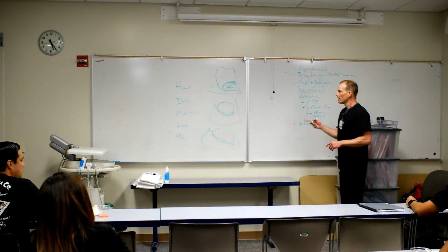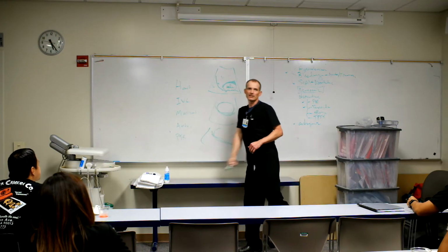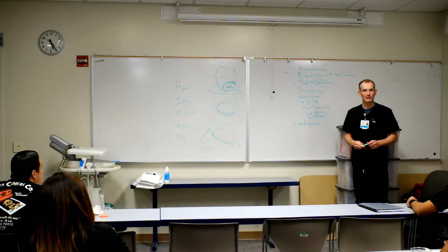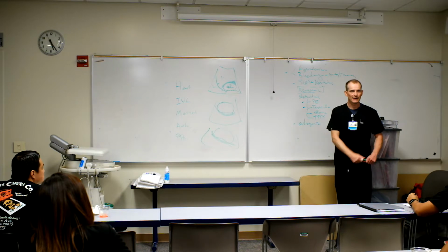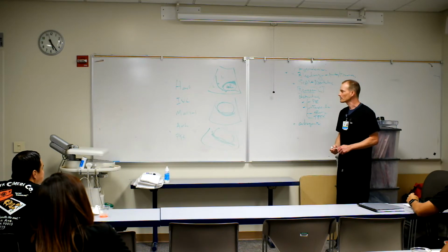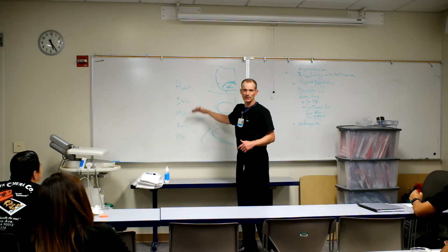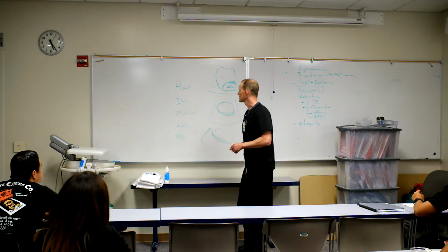Okay. But what I would say though is if you see that, you still want to do this whole thing, because what if she has a pregnancy-induced cardiomyopathy, or she got a viral cardiomyopathy and she's got this big LV that's failing, right? So ideally you don't just come to a conclusion before you're done looking at everything.